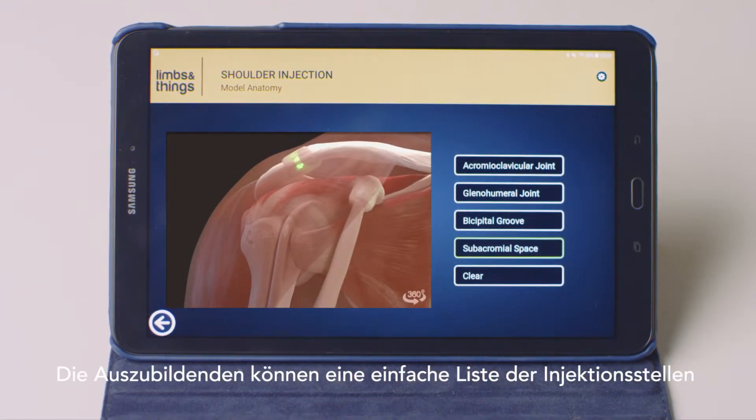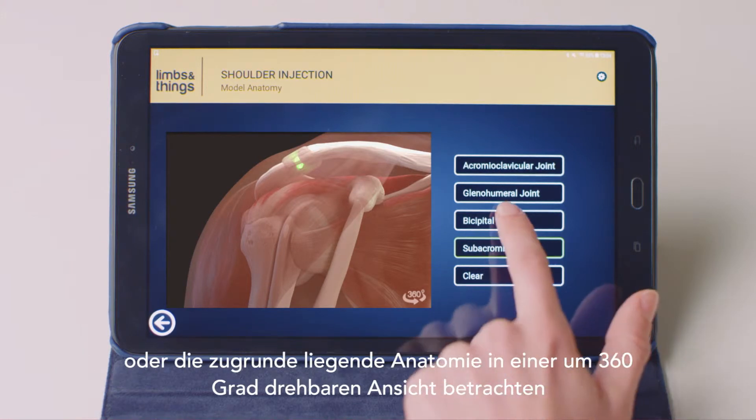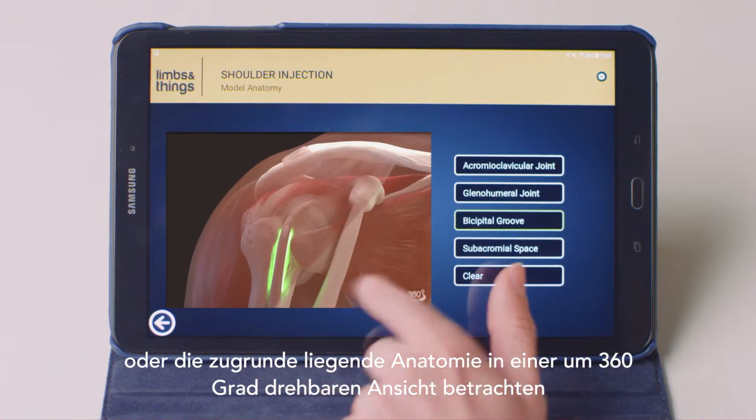Trainees can view a simple list of injection sites, or the underlying anatomy in a 360-degree rotatable view.